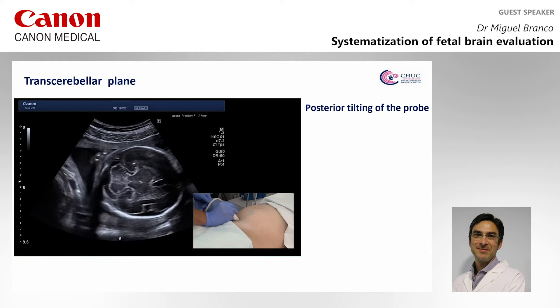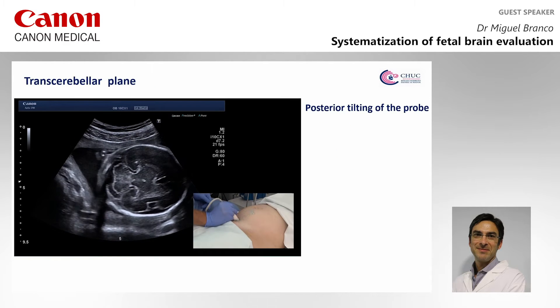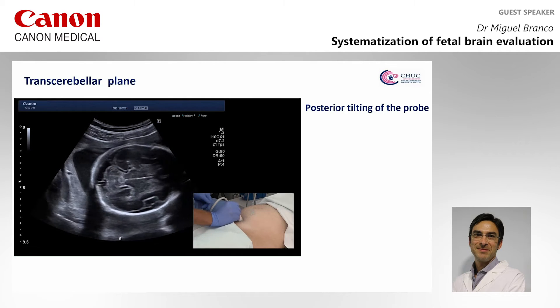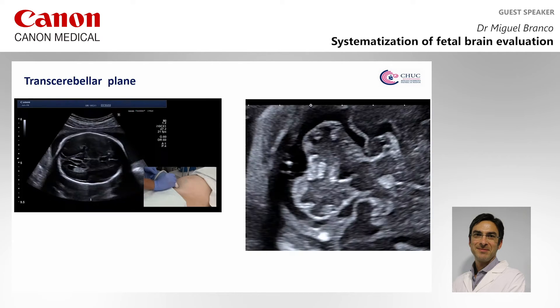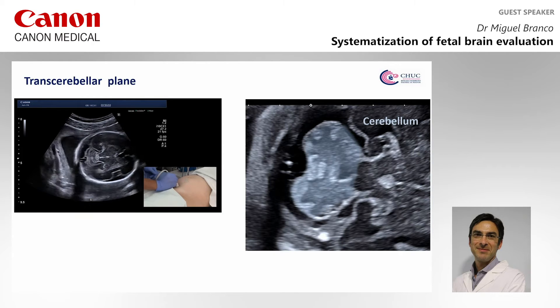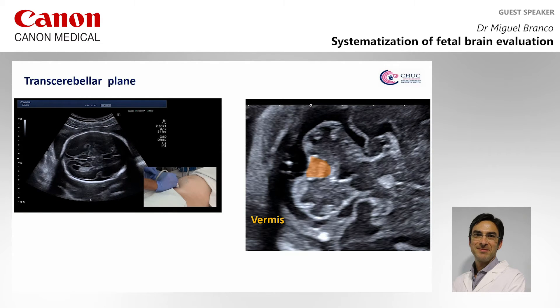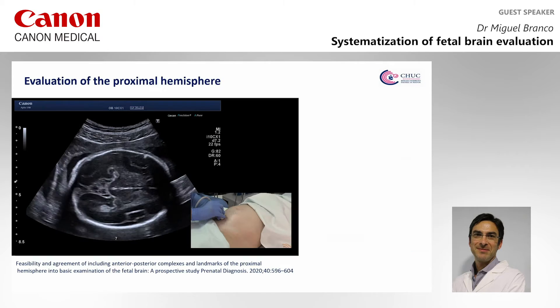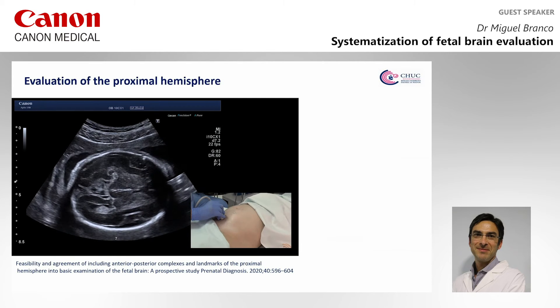With the posterior tilt of the probe, we will gain access to the posterior fossa. In this way, we can study the cerebellum, the slightly more echogenic vermis, the fourth ventricle — short and wider — and the cisterna magna. We can also evaluate the distal as well as the proximal sylvian fissure.